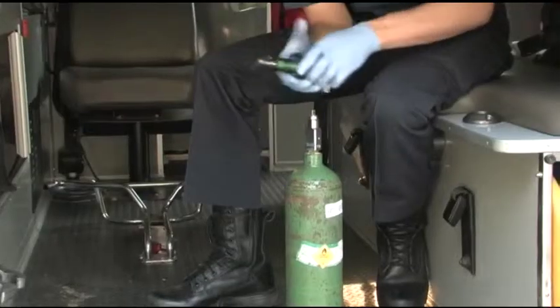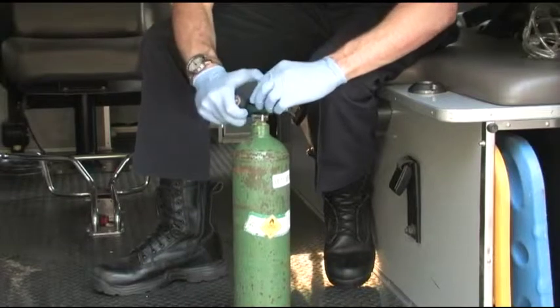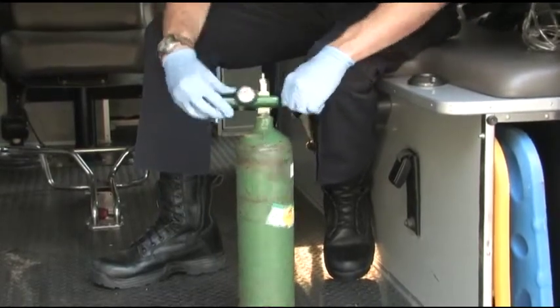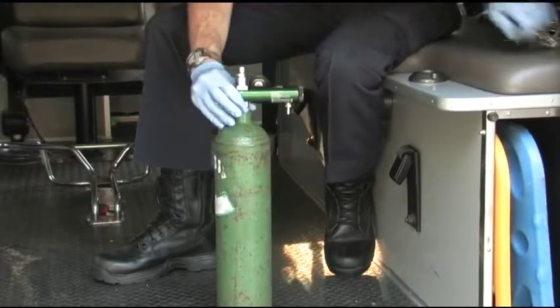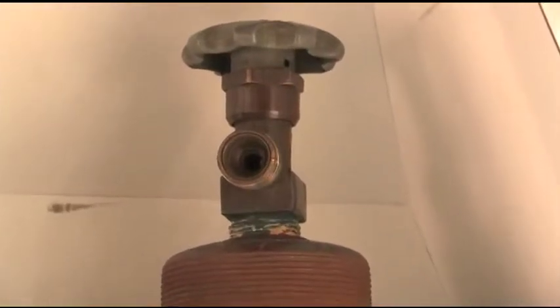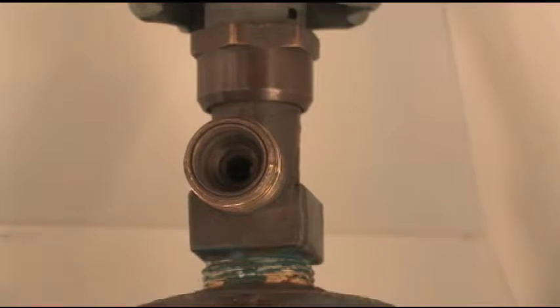On E-size cylinders or smaller, the pressure regulator is secured to the cylinder valve by a yoke assembly. This is called a pin index safety system. This system prevents an oxygen delivery system from being connected to a cylinder containing another gas because the pin position varies for different gases. Cylinders larger than the E size have a valve assembly with a threaded outlet. The inside and outside diameters of the threaded outlets vary according to the gas in the cylinder. This is to prevent an oxygen regulator from being connected to a cylinder containing another gas, such as helium or nitrogen.